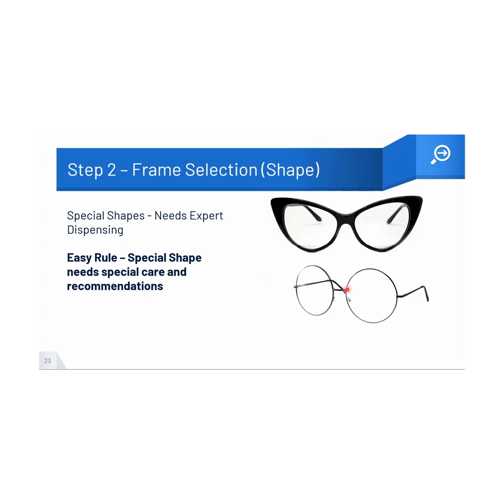So generally, I would say the benchmarking of distance zone to be 12 mm, 13 mm doesn't hold good here, because you can also have distance zone as big as 15, 18, 20, 22, right? So you'll have to be careful what you are actually giving. So basically, fitting height plays a very important role when it is round shape. And aviator. Now, aviator and cat eye is not recommended for the reason that they may actually cut the reading zone based on the pupil.